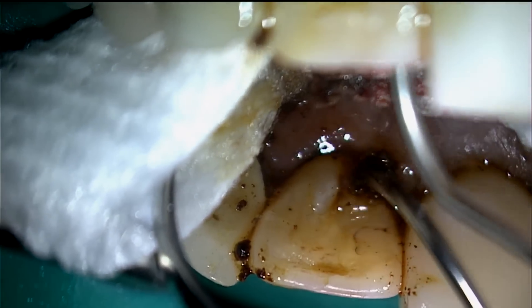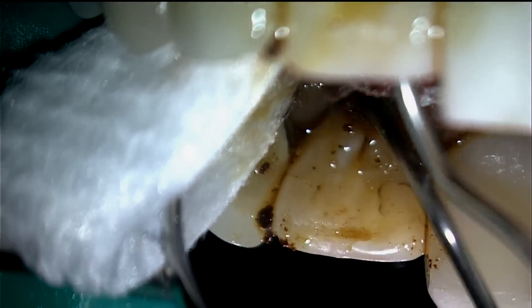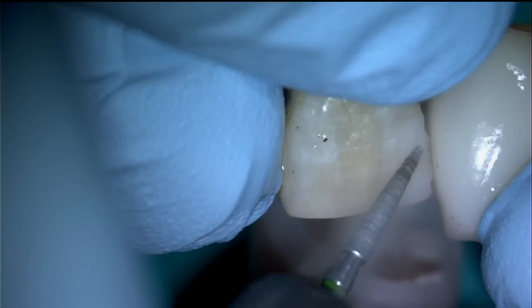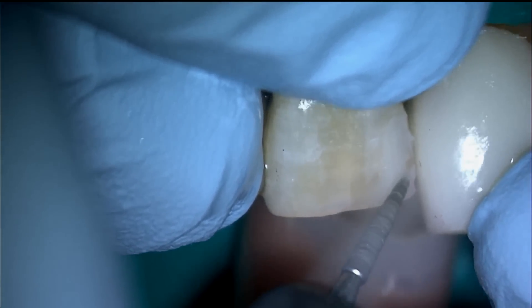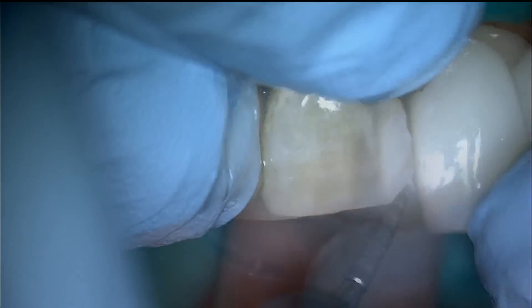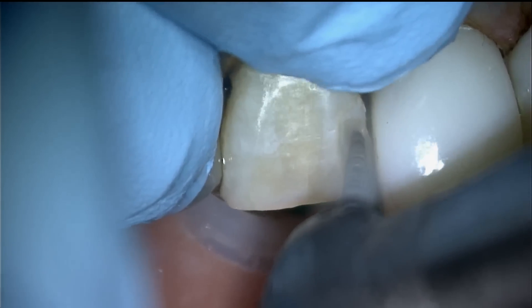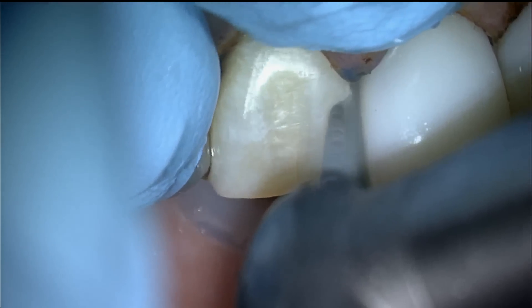In this case, the deep composite is removed with a coarse flame diamond burr. If the old composite is well bonded, the deep composite does not need to be removed. In this case, the old composite was leaking, so all of the old composite was removed.